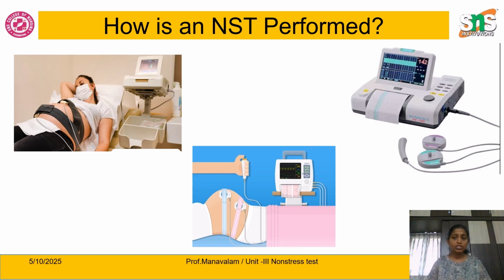During the procedure, if there is less fetal movement and the mother doesn't feel any fetal movement, we can give external stimuli, like making the mother move from side to side, or having something to eat. Or we can use vibroacoustic stimulation. Any type of method we can apply to stimulate the baby, in order to wake the baby up if the baby is sleeping. So these are all the ways we have to do the NST.